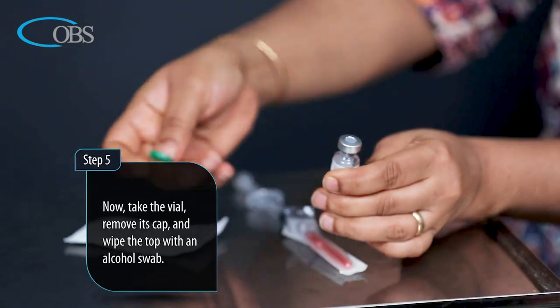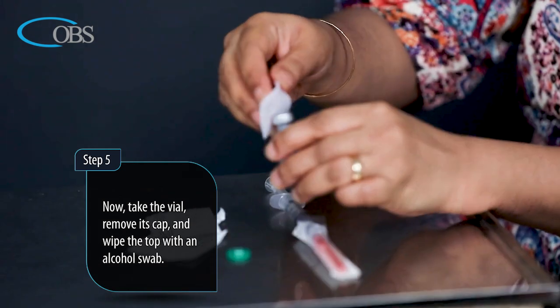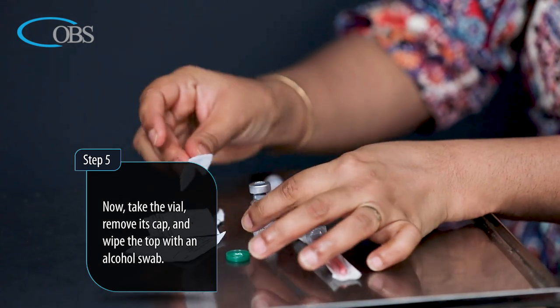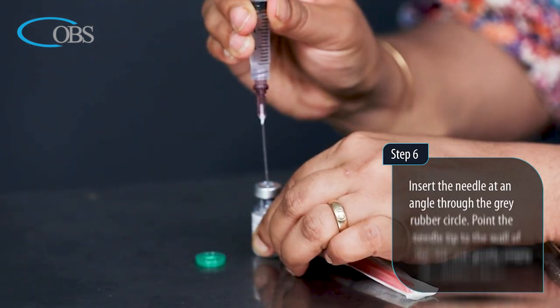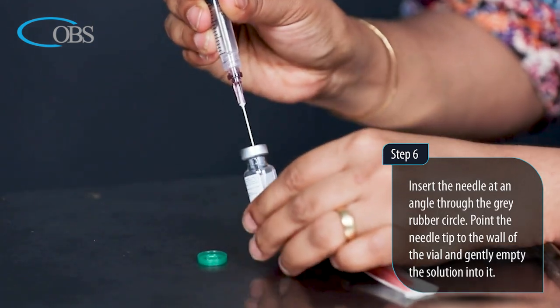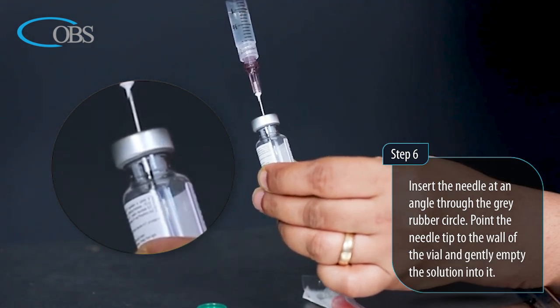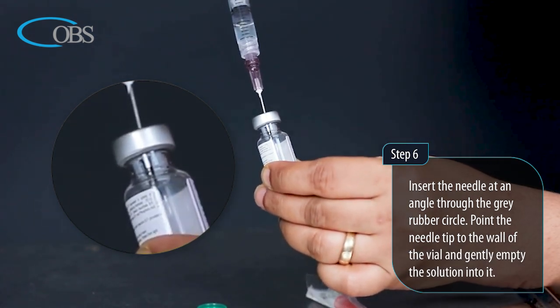Step 5: Take the vial, remove its cap, and wipe the top with an alcohol swab. Step 6: Insert the needle at an angle through the grey rubber circle. Point the needle tip to the wall of the vial and gently empty the solution into it.